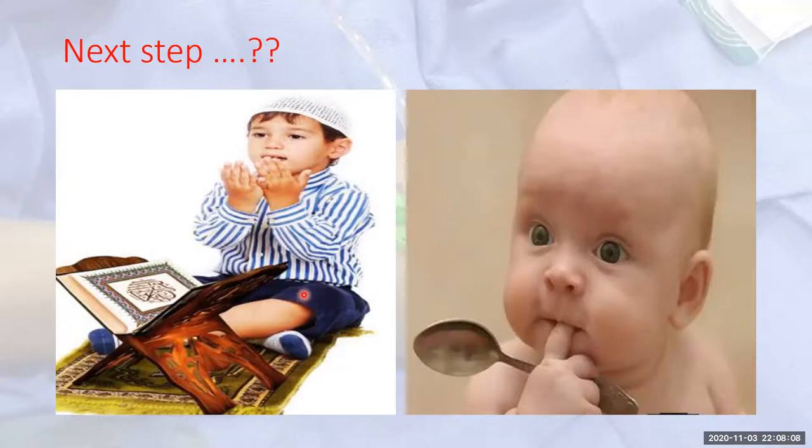Okay, I'll be happy to share knowledge with our colleagues, but what I thought at that time was that the STEMI started in the branch, which we'll see later, and it propagated retrogradely to occlude the left main. That was my thinking at that time. Because again, it's another window. We don't have any explanation for this. So we all agree that we have to pass a wire and see what will be next, right?